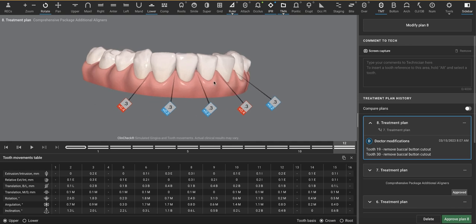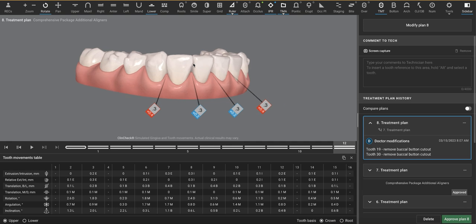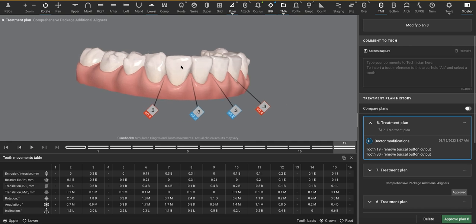The last thing I'll say is when we program IPR, especially lower teeth, the lower laterals are often wider than the lower centrals. When we do IPR, Invisalign is just saying create space. They're not telling us that we need to take 0.15 millimeters of enamel here and 0.15 here. We can control through the use of one-sided diamond discs. So you have to intentionally order those IPR discs so that in a situation like this, you're reducing the wider tooth. You don't want to reduce 50%, 50%. Here, I would do 100%.